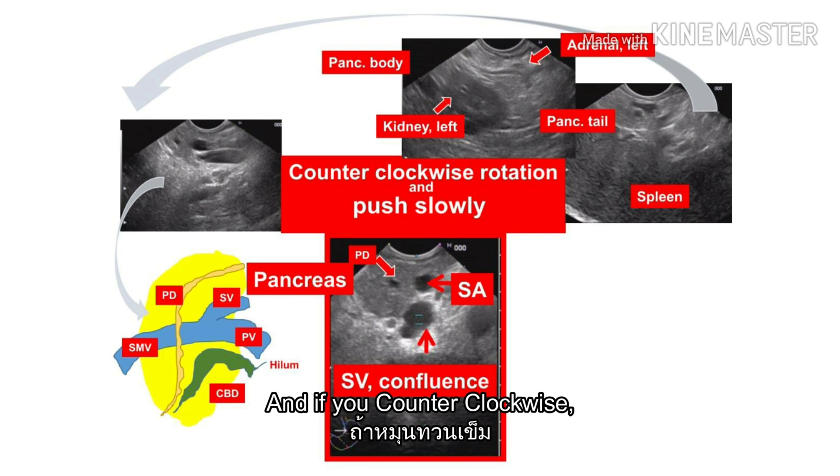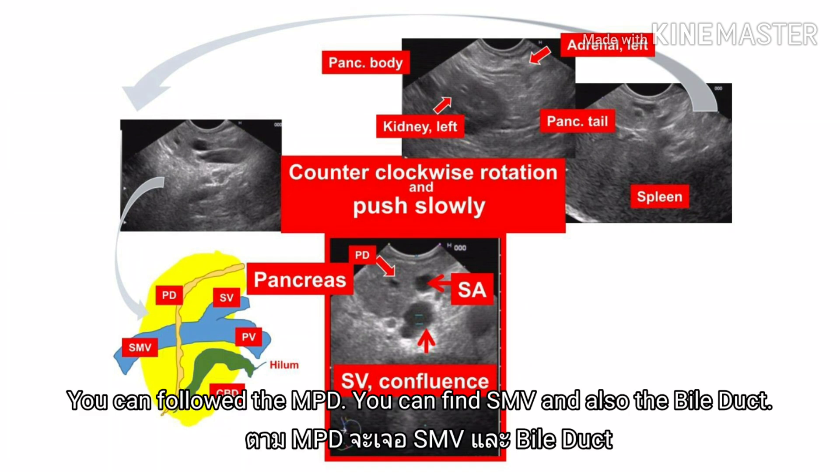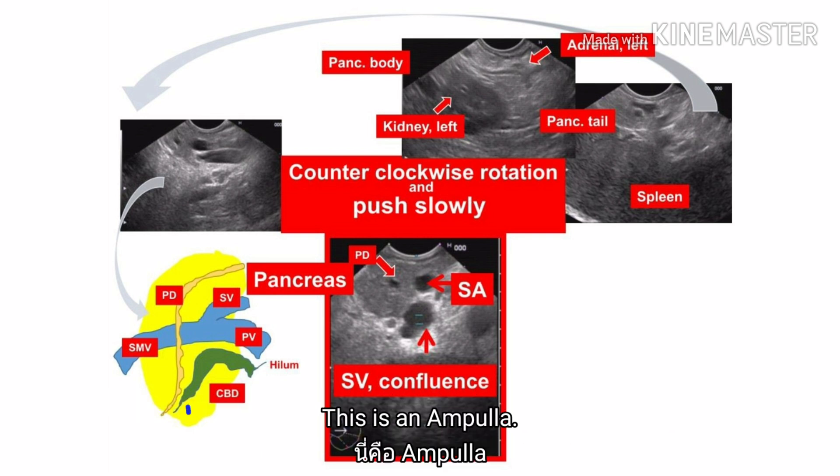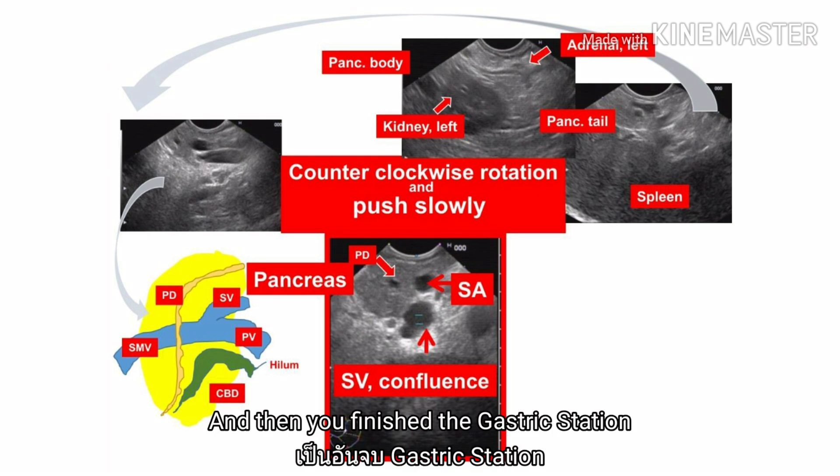And if you counterclockwise past the genu and go down, you can find this picture. You can follow the MPD, find the SMV, and also the bile duct. Then pull back again the same way. And then you finish the examination at the cardiac station.